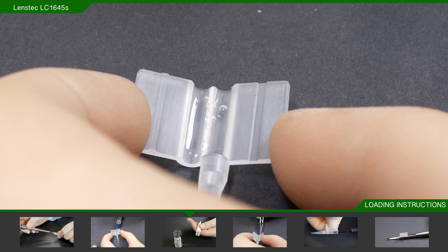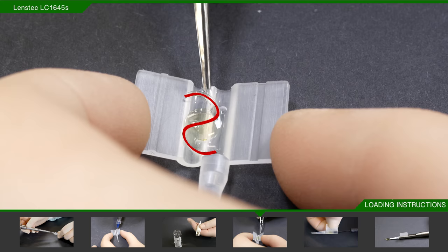Take the cartridge and hold it either between your thumb and second finger with the tip facing your palm, or hold the cartridge flaps between your thumb and first finger on a flat stable surface, such as the scrub table. At this point, be careful not to fold the flaps back too far.